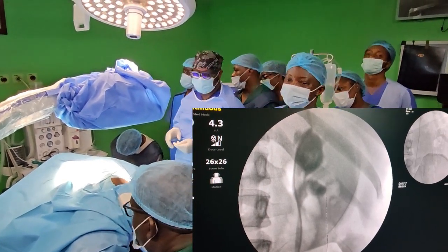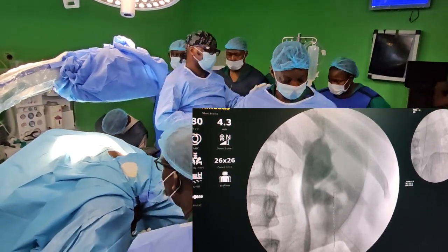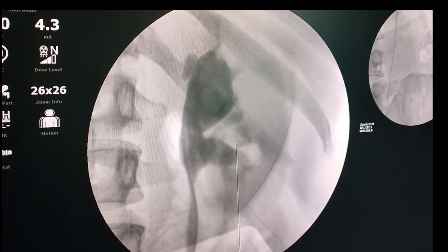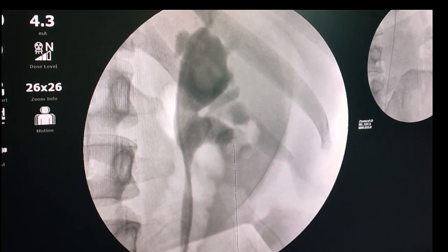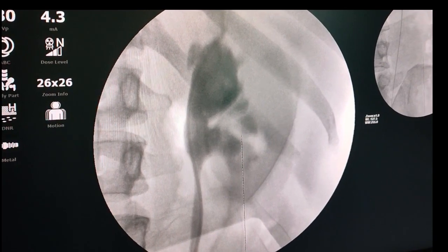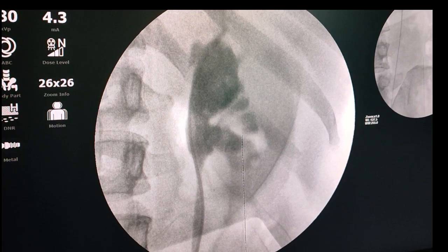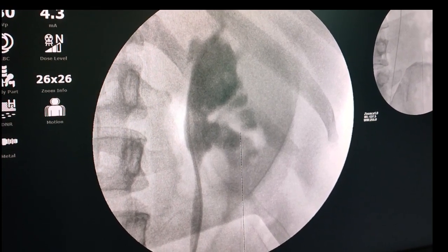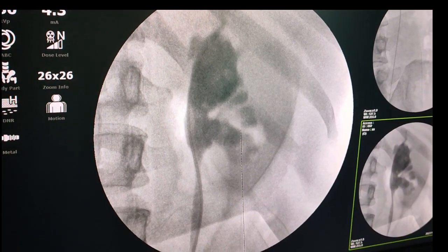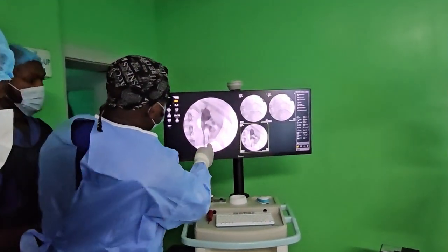Hold on. Now give me space. Let me go to that. I want to explain something. Yeah, excellent. Stop. Continue. Are they seeing it? Yes, we can see it clearly.